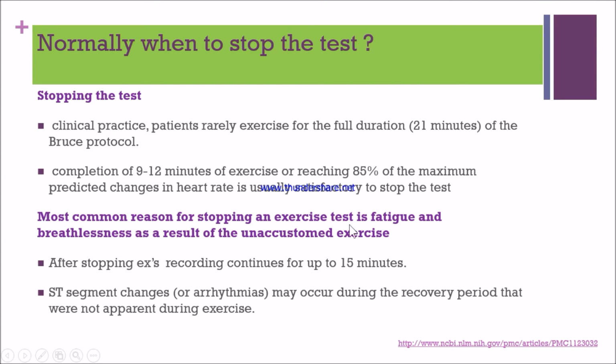The most common reasons to stop the exercise test are fatigue and breathlessness, and they are the result of being unaccustomed to exercise. After stopping exercise, we need to continue recording for up to 15 minutes, because at this time we may note some ST segment changes or some kind of abnormality. ST segment changes or arrhythmia may occur during the recovery period, and if we are not aware of this, we could miss them, so we need to check during the exercise testing.